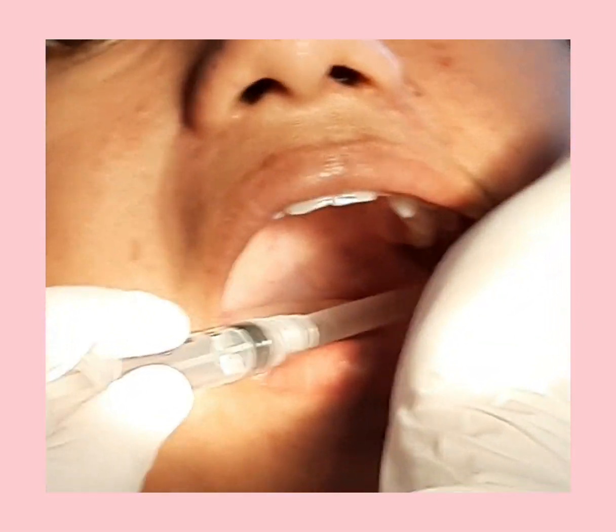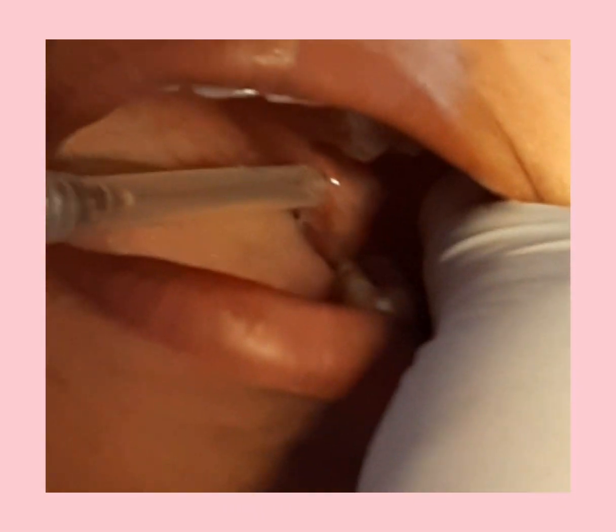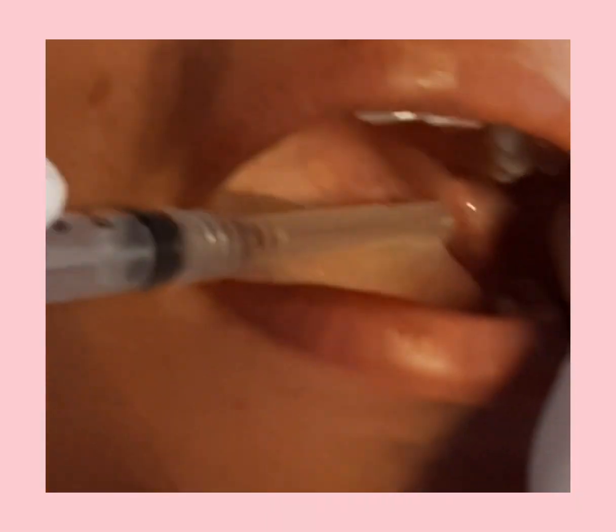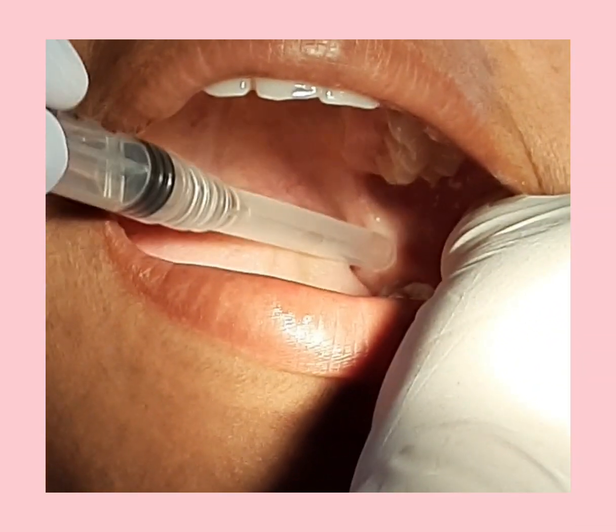Just keep in mind that you keep the needle at the corner of the mouth. If you approach it from the bicuspids or from the angle of the mouth, it will get really easier for you to inject. You are halfway through if you keep the syringe at the angle of the mouth.